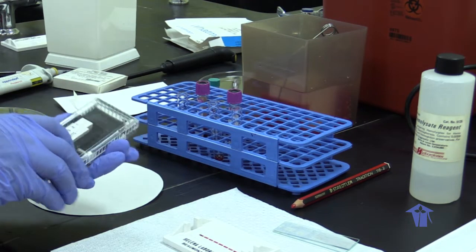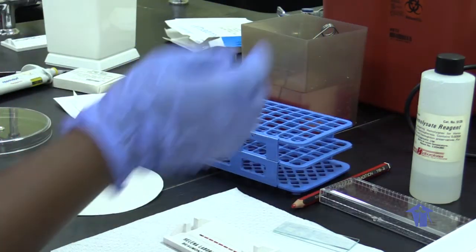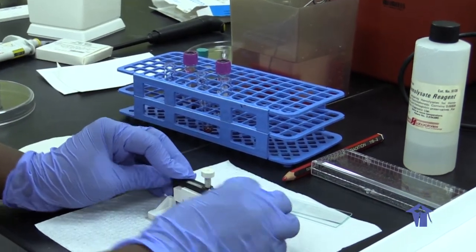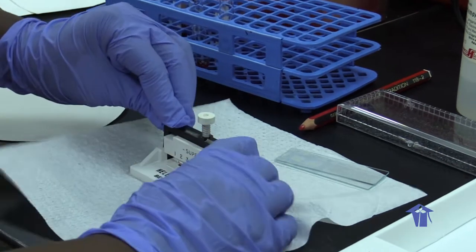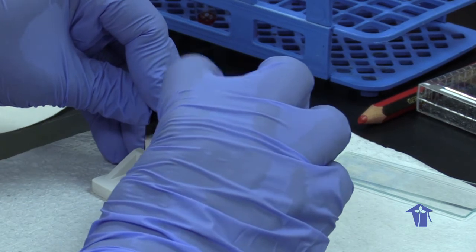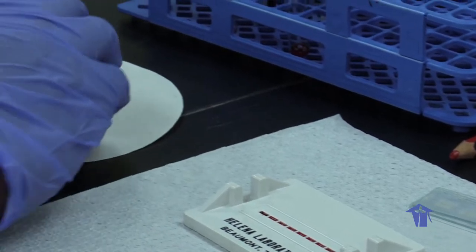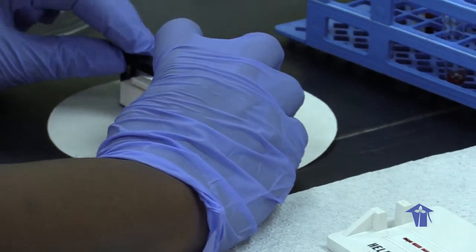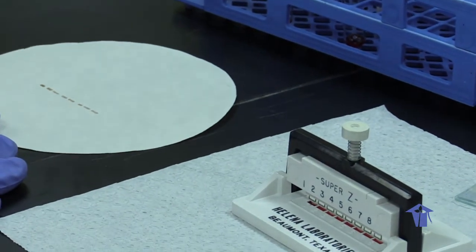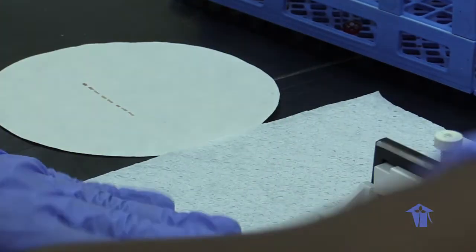So now we're going to prime our Zip Zone sample applicator. Going to put it facing forward like that onto the wells. Going to hold firm and go down 3 to 4 times. 1, 2, 3, 4. Then we're going to put it onto our filter paper. Okay. This step is very important to make sure that we have equal amounts of the sample onto the plates and to get rid of any excess.